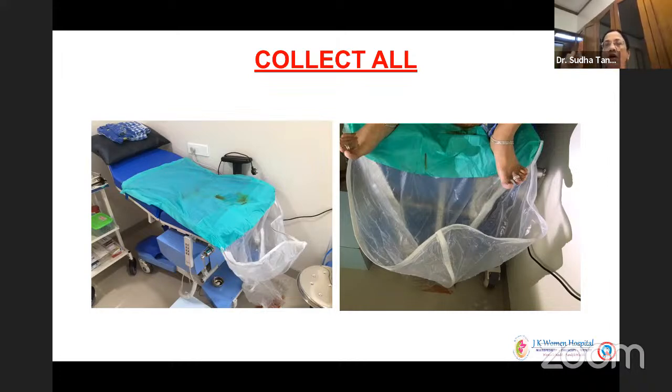Also, when you're using those 4-liter pressure bags, there is something which is left in the bottle. So that also should be calculated, along with what comes into the bucket. I think for all these calculations, one should be training the people in the OT, the staff.